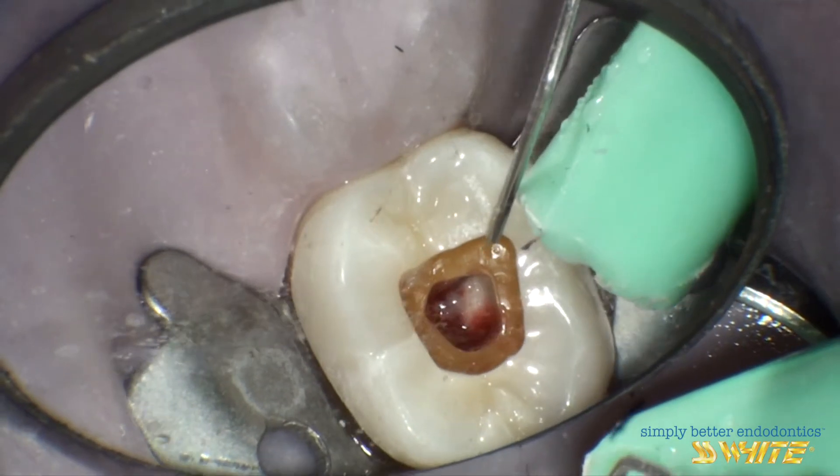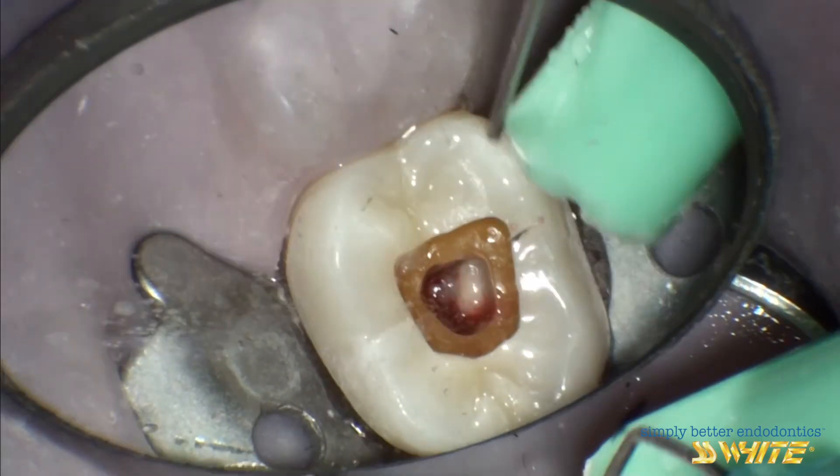This is the finished-step access with a wider, shallower opening through the crown, and a narrow, more conservative access into the pulp chamber. It is just wide enough to give access to the canal system and maintains as much cervical dentin as possible. The result is a tooth with maximum residual strength, yet one where our endodontic objectives can be gracefully met.